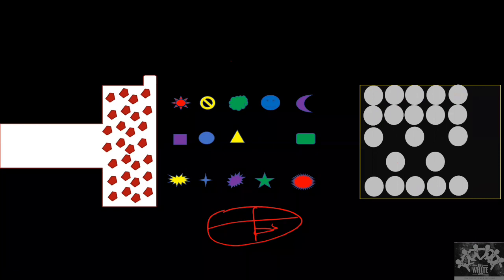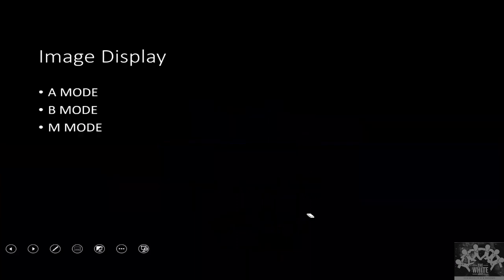Okay, so this is how we see a moving structure in M mode, especially used to see the movement of the heart in the fetus and see the heartbeat. Okay, so this is how we get a linear structure, and the wavy structure suggests that movement is happening. This is about the M mode.